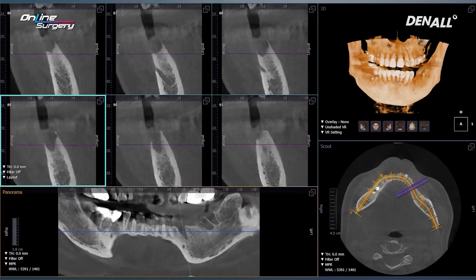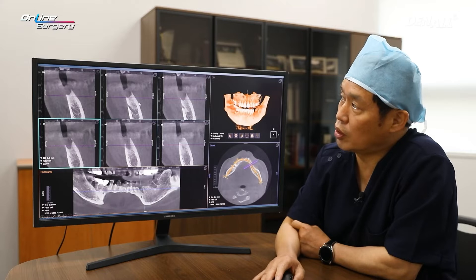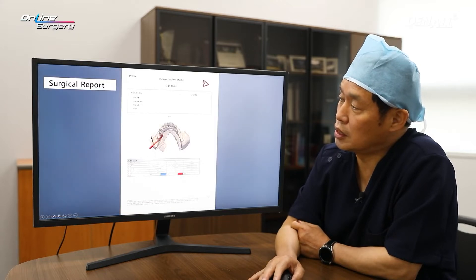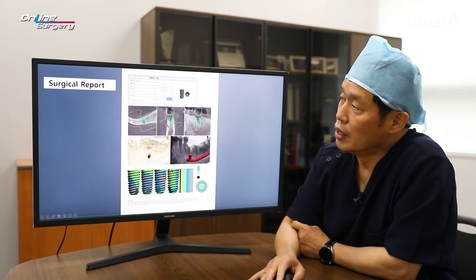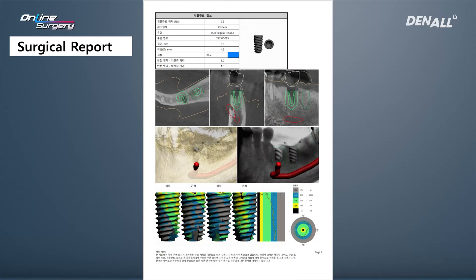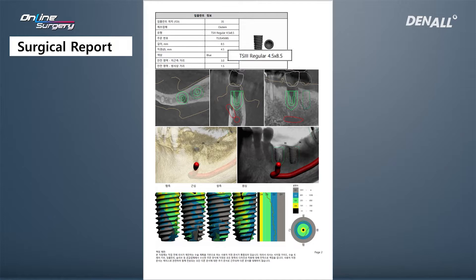As you can see, in number five the buccal plate is resorbed significantly. The mental foramen is here. I contacted the one guide team to design the one guide. In number five, the mental foramen is coming up like this. A 4.5mm diameter by 8.5mm length implant was planned.